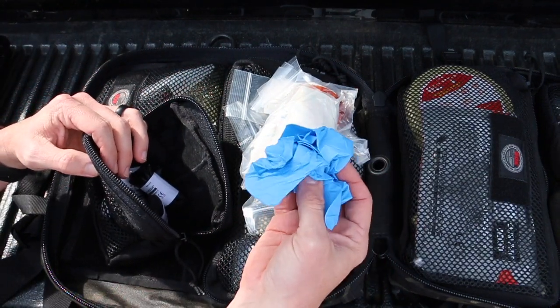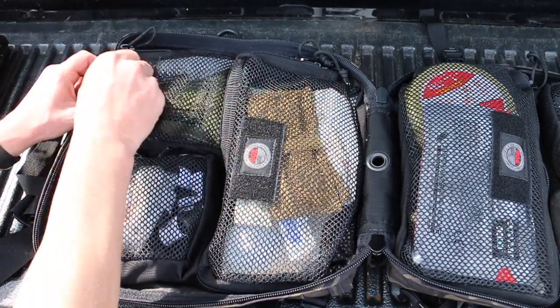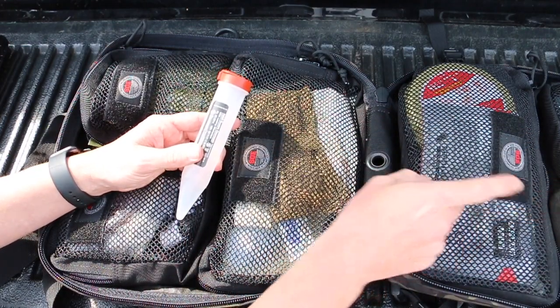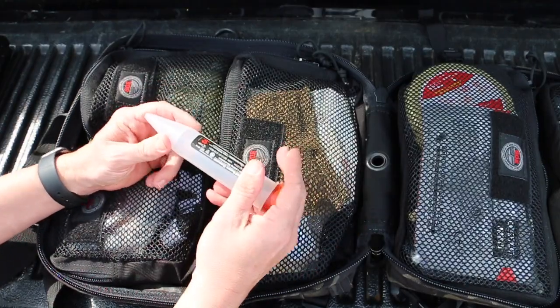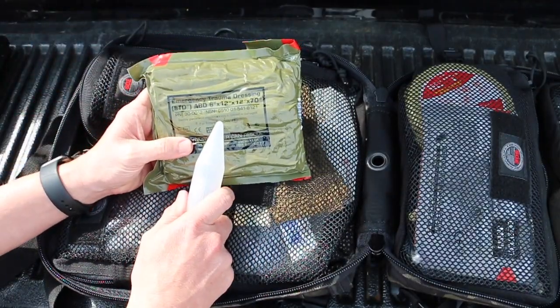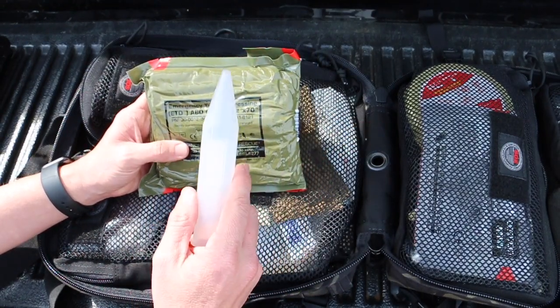The EMS nitrile gloves are what's most important to access quickly. There's also a sharps container here. My IV supplies are in a separate bag so that no other responders get stuck if I'm handling needles and IV supplies. And then I have a large pressure bandage in case I need it — I also have another pressure bandage elsewhere, but this is the large one.